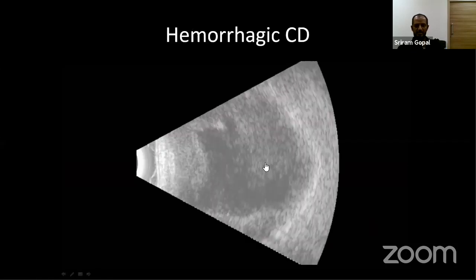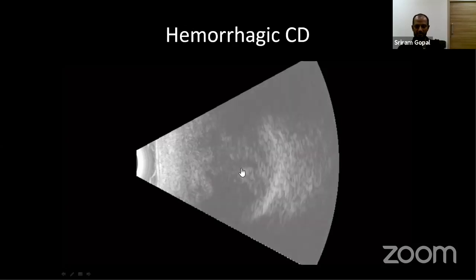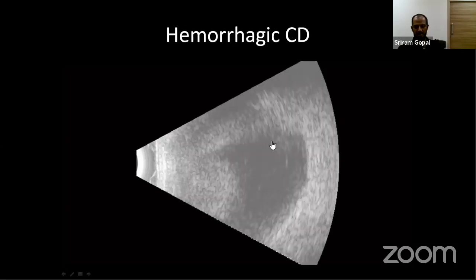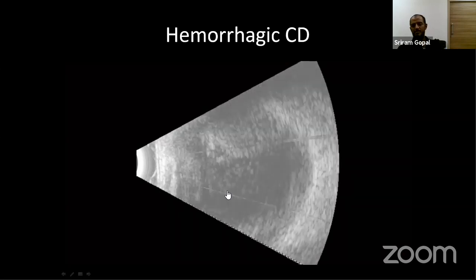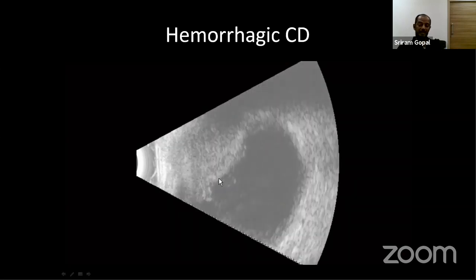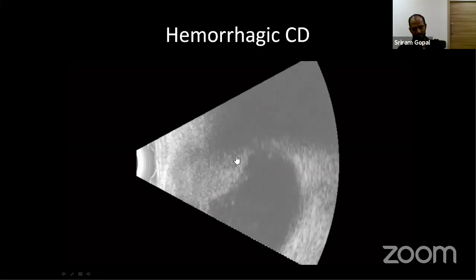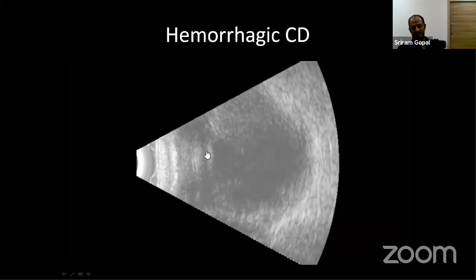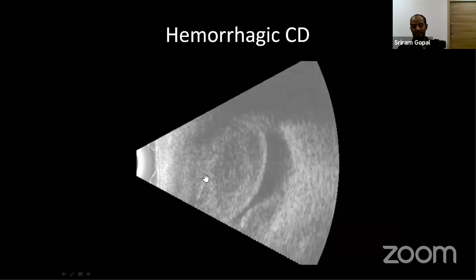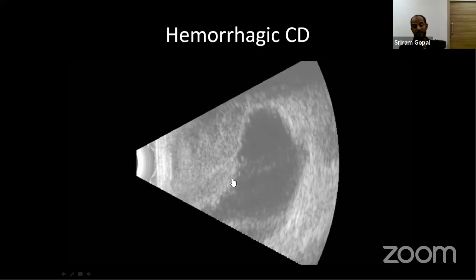As opposed to this patient who had an expulsive hemorrhage intraoperatively, the whole eye is full of echoes. You see these dome-shaped elevations, but the suprachoroidal space in these cases is full of echoes, meaning it is full of blood. Ultrasound is very useful in these patients to follow for emulsification or liquefaction of this blood. When a significant amount of blood is liquefied, there are more darker areas, which is actually the right time to go in to evacuate these hemorrhagic suprachoroidal detachments.